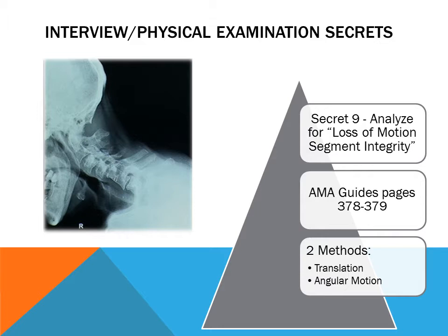No? You don't do it on every single case? Do you do it on every other case? Every third case? Do you do it at all? I'm going to encourage you to perform an analysis for loss of motion segment integrity on every single spine case.